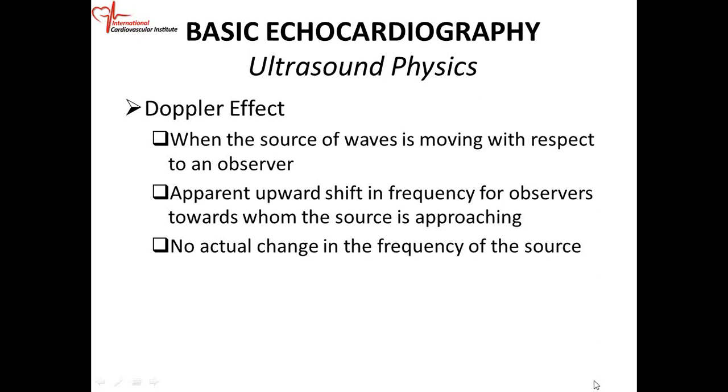And today's session is on the Doppler effect. I know we have done the Doppler effect before we did diastolic function and dysfunction. But just going over the Doppler effect is very important, because more than 50% of what we do in echo is the Doppler. And then when we go on to vascular ultrasound, the majority of that is the Doppler effect.